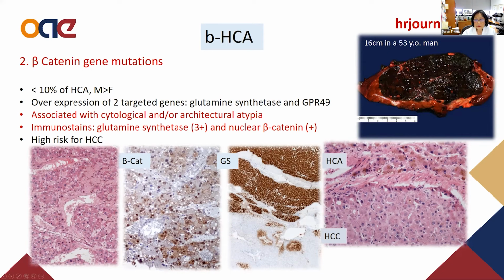The architectural atypia is a nodule within a nodule, and sometimes it's not easy because HCC that develops in adenoma very often is well differentiated, such as this one.